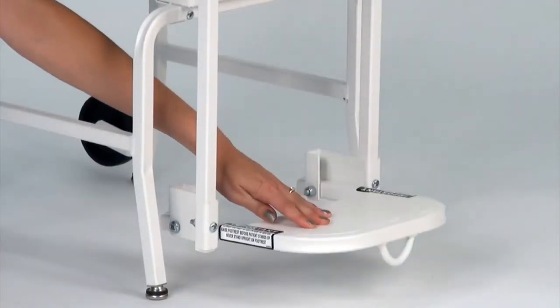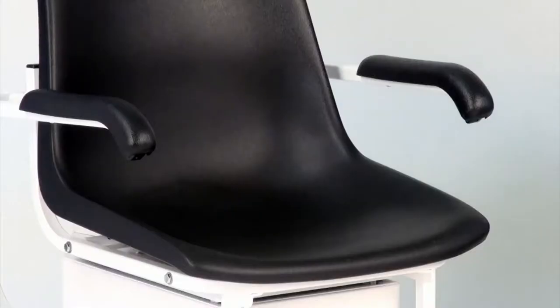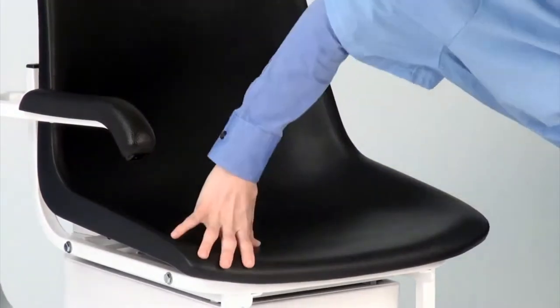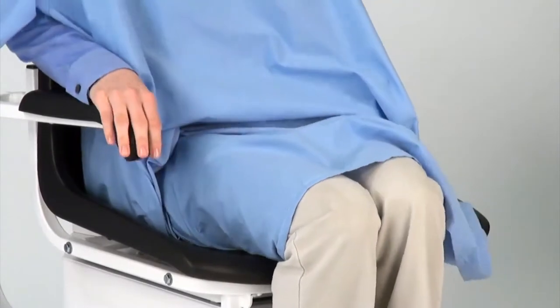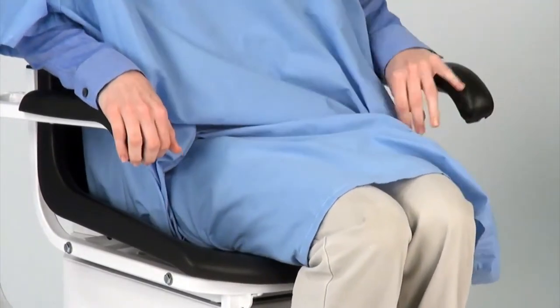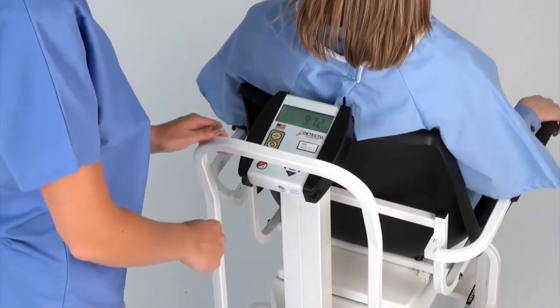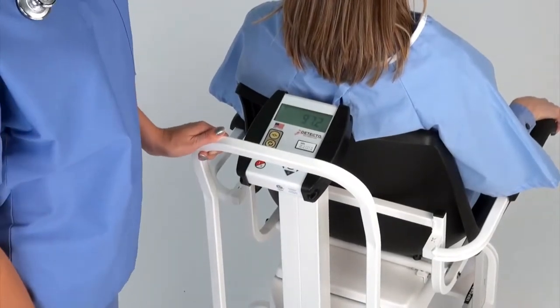The retractable footrest provides additional patient support while weighing. Lift-away armrests on both sides of the scale allow patients to access the chair laterally from either direction. This is especially helpful if the patient is transferring from a wheelchair or moving onto the scale from a bedside. Once properly seated in the ergonomically designed chair, the patient may rest comfortably while their weight is measured on the scale by clinical staff.